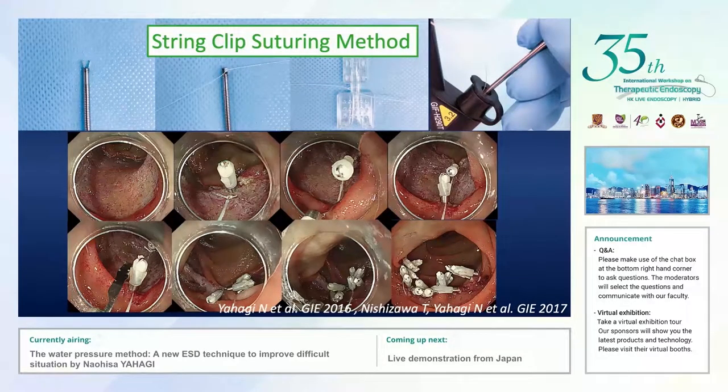Even after a successful ESD procedure, delayed complications can occur in the duodenum due to the presence of pancreatic juice and bile acid. Therefore, complete closure of the mucosal defect is very important to avoid serious delayed complications. We developed the string clip suturing method to achieve complete closure of the wound.